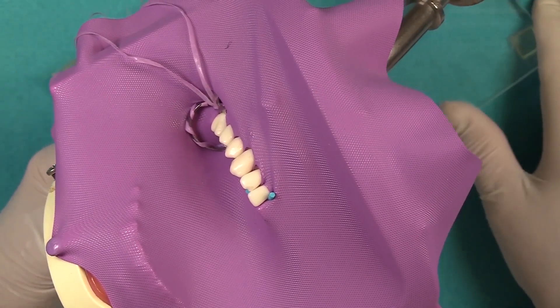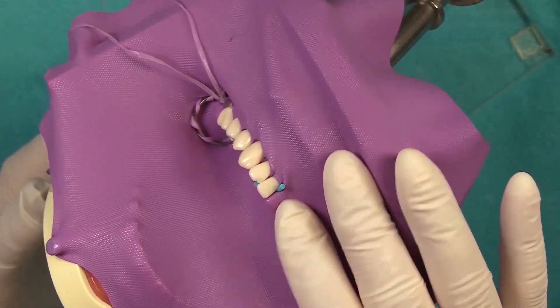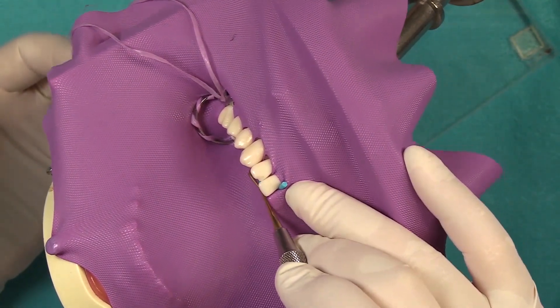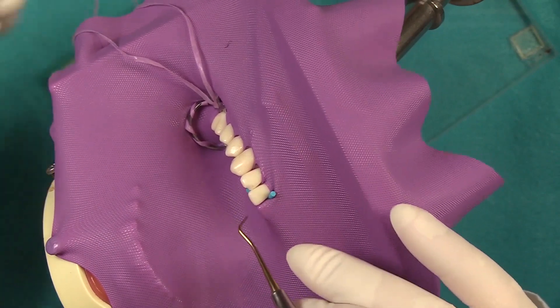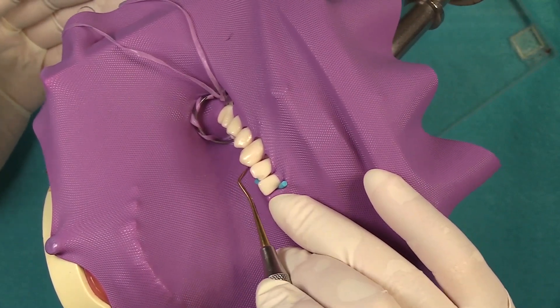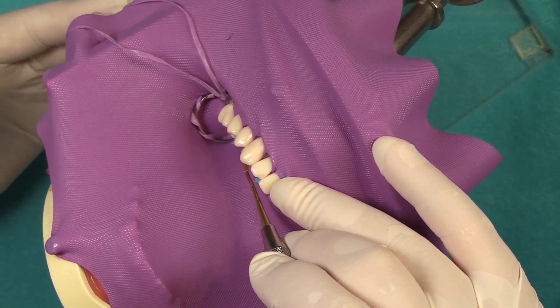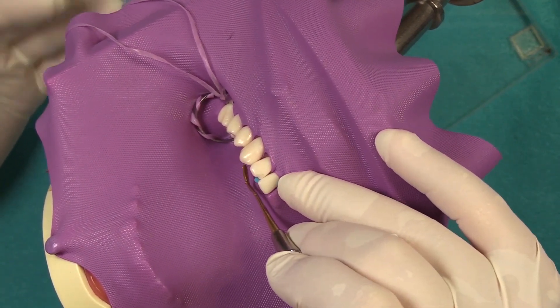When you're dealing with leakage, another issue is checking the dentition. Obviously, our patient has perfect dentition. But let's say if the tooth was somewhat to the lingual inclination, then you would have to punch your hole accordingly so that the dam wouldn't pull and tear in such a manner to cause leakage. Obviously, if there's a missing tooth or a greater spacing than usual, you have to compensate by punching accordingly — making enough coverage for that space so you don't get leakage.